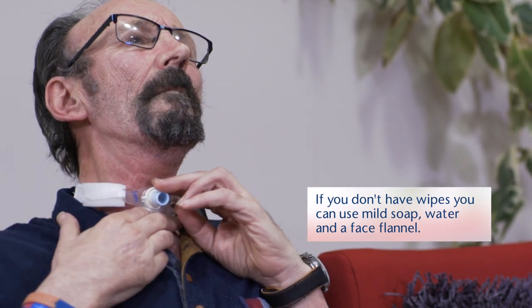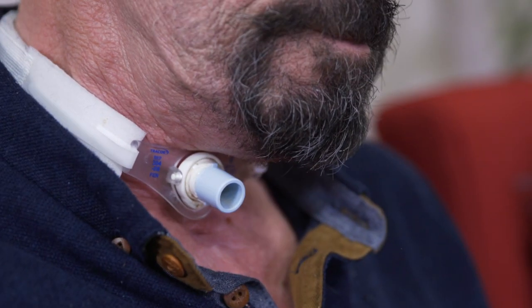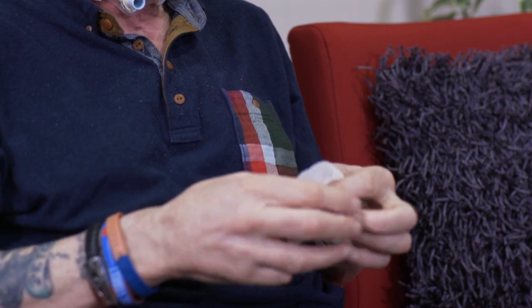Clean any crusting around the stoma and under the flange and tapes. Try not to worry if you cough during the tube change — this is normal.